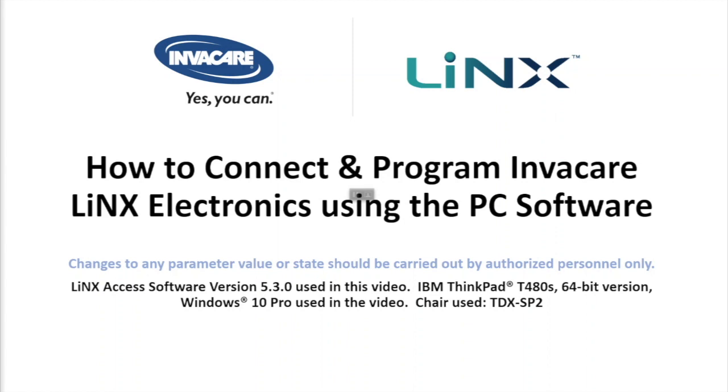In this tutorial, we will be showing you how to connect and program the Invacare Lynx Electronics using the PC tool on a Windows laptop.